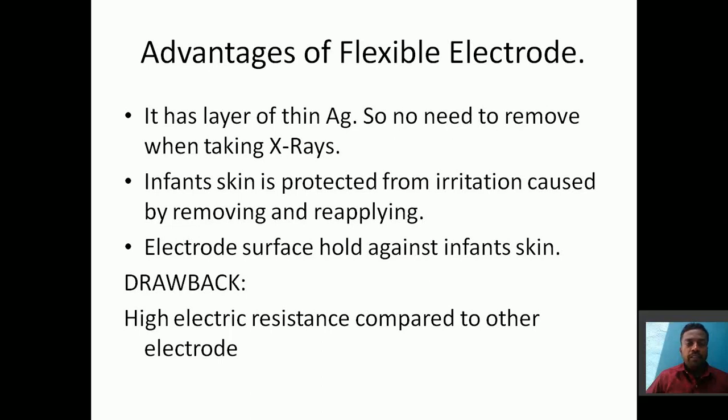For example, if you wear any chain, we have to remove our chain, because the metal element on our body will affect the signal. If you have a pin in your shirt, we must remove that pin, or it will affect the output.